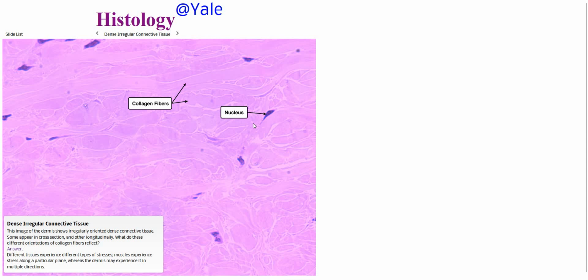Collagen fibers. There'll be some other types like elastic fibers. So a lot of fibrous stuff and fluid and gel and just extracellular matrix. That is what we're talking about today. There are some special types of cells found in connective tissue. So these are called fibrocytes and fibroblasts. And the way to tell those apart is fibroblasts are going to be actively making new fiber. So they are making things, whereas fibrocytes are the mature version of the cell. So they're not doing a whole lot. They're just hanging out and kind of maintaining the fibrous tissue.